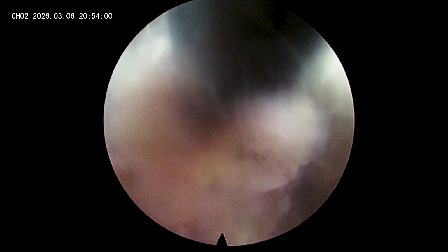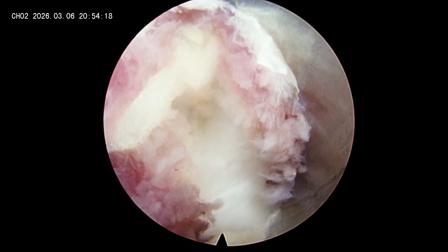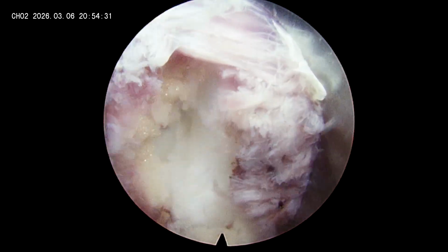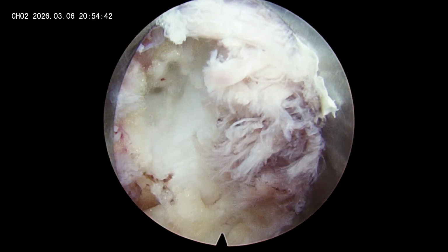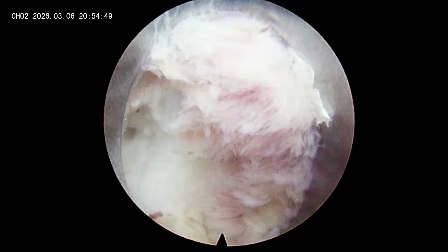Now this is the way you can remove the soft tissues from the interlaminar window. You can already see there is a yellowish structure lying just beneath the soft tissues, which is nothing but the ligamentum flavum. At every step, whenever you see any bleeding, coagulate those vessels. There are some bleeding vessels at the 5 o'clock position coming from the soft tissues. Coagulate those vessels and again remove the soft tissues in the interlaminar window.